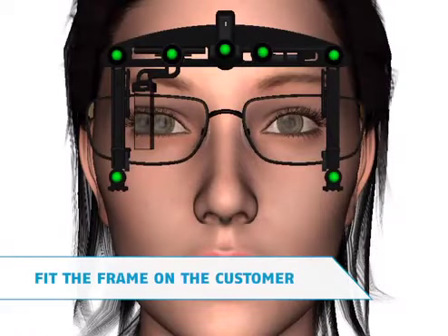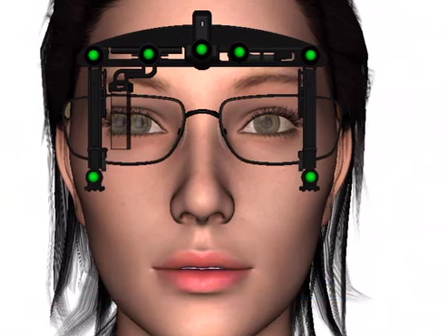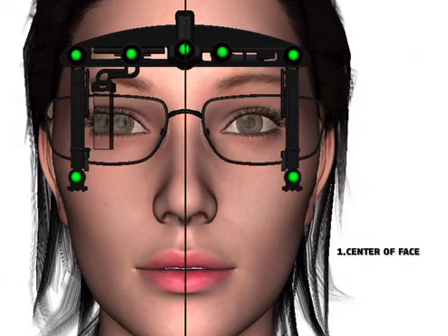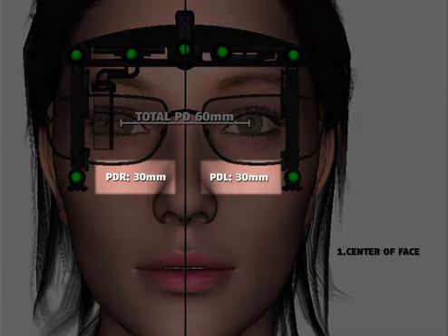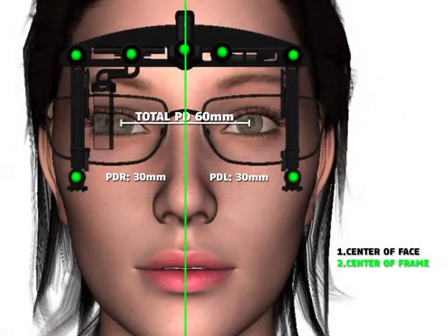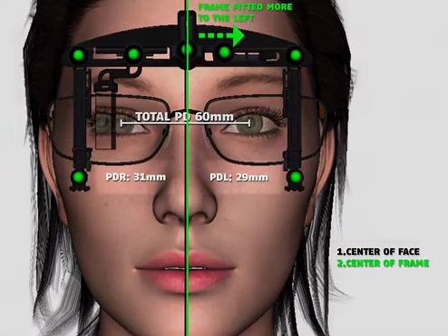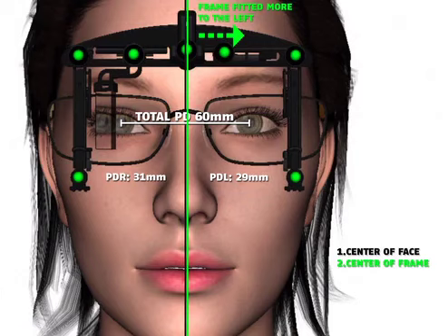It's critical to properly fit the frame in the way it would be dispensed prior to performing measurements with the OPD. Unlike the pupillometer, the OPD measures how the frame sits on the customer's face, making the frame fit critical as it will affect monocular PD and fitting height measurements. Note that a pupillometer's total PDs will be the same as the electronic measurement total PD, but the monocular PDs may be different since they are as-worn measurements.